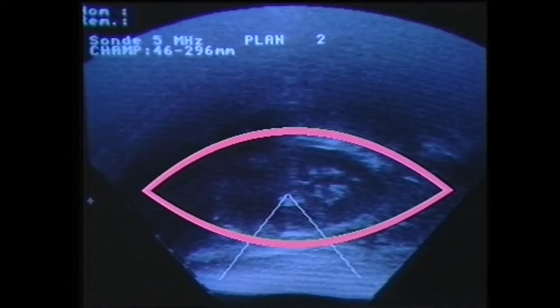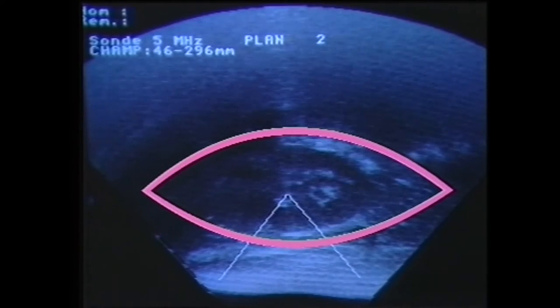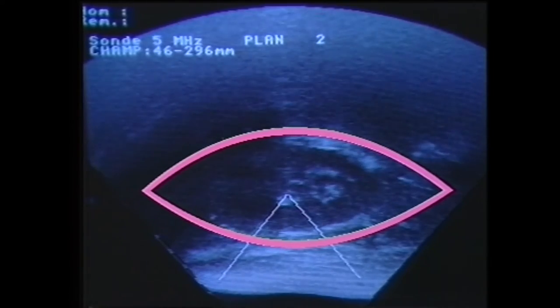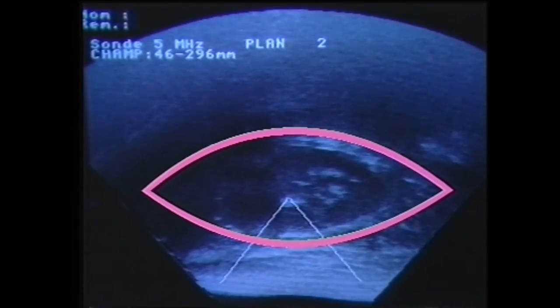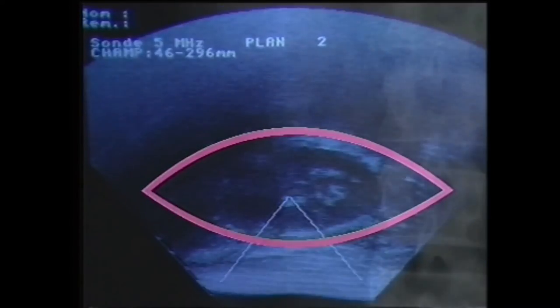Nous laissons ensuite en place la sonde urétérale afin d'éviter que la pierre ne redescende. Cette image ultrasonographique nous montre la coupe longitudinale du rein avec le sommet du triangle qui représente le point d'impact des ondes de choc. Sur cette radiographie faite le lendemain de l'intervention, on constate l'élimination du calcul.